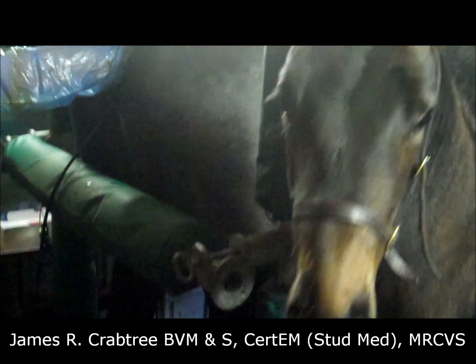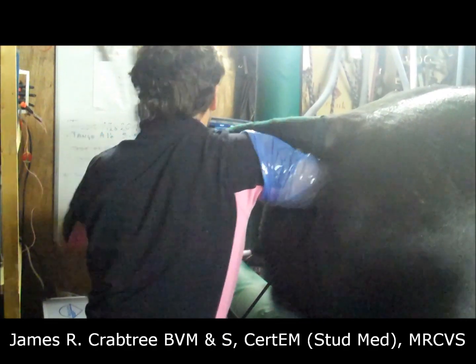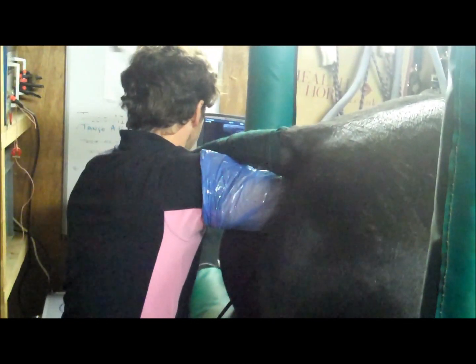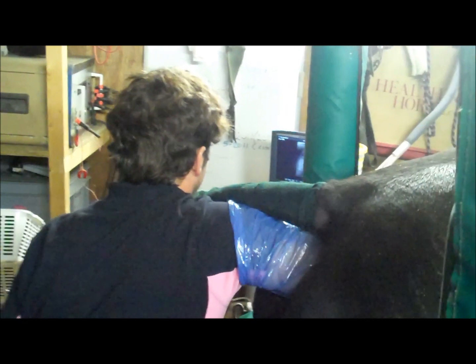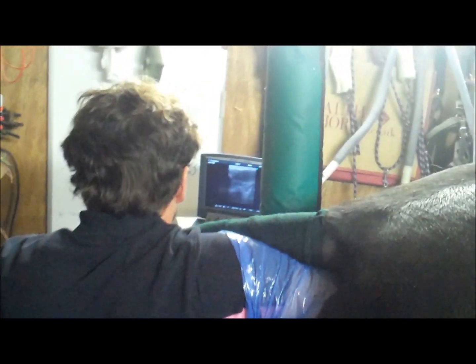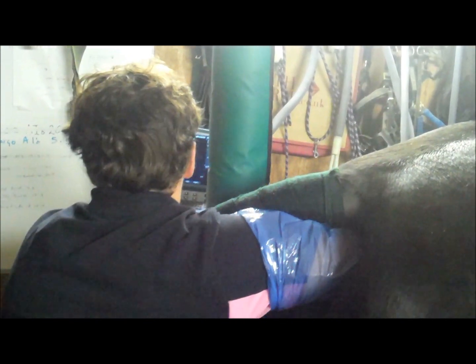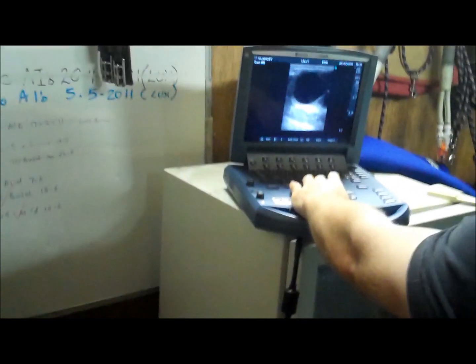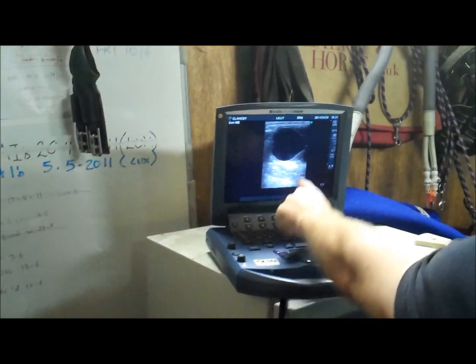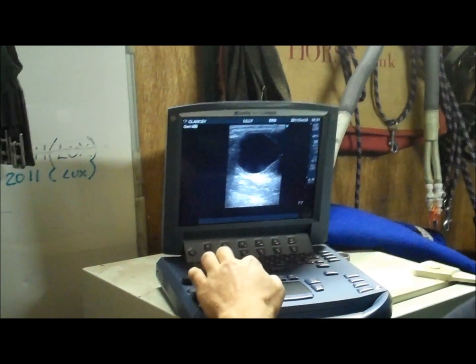She's in season. Nice big follicle with a little wall around it. See the slight thickening of the wall? Nice, reasonable size follicle.